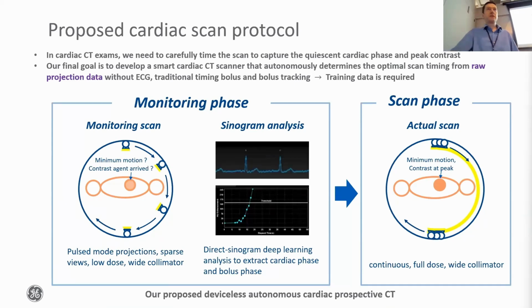So the overall goal of what we'd like to achieve with this project is we'd like to make cardiac CT exams more robust, easier, and less prone to user error or non-idealities from variability induced by different users, and also make the scan faster and easier as well.